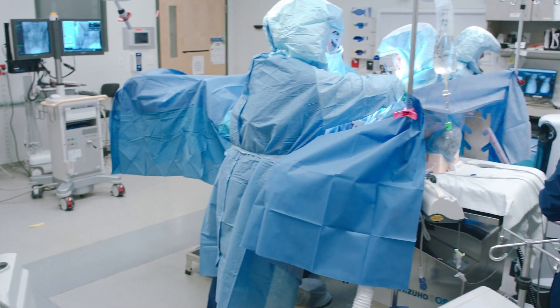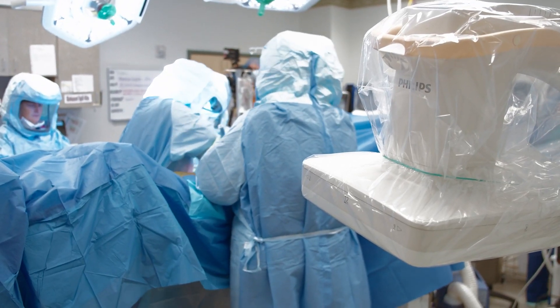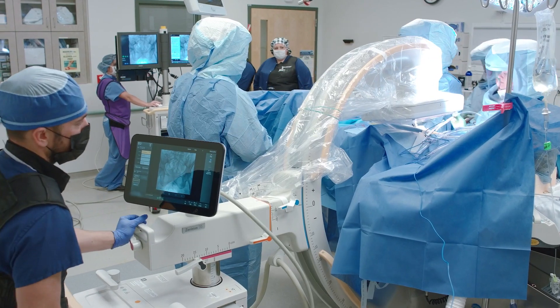Its small footprint and the ability for the C-arm to not take up a large area within the OR that we're trying to keep sterile is something that's really been a benefit.